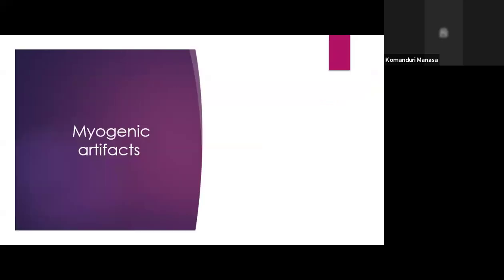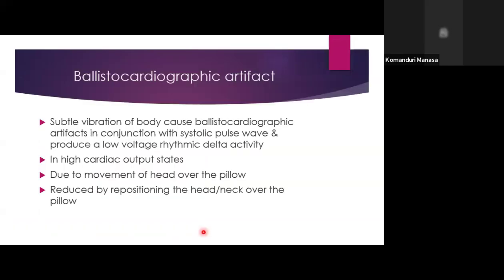We don't commonly get this, and I didn't get an image of that. In fMRI, there are studies which looked into ballistocardiographic artifacts. These artifacts are a concern in combined EEG-fMRI. It is an important artifact transmitted through the whole signal that requires motion correction. Those are more important in the EEG-fMRI studies, where we get to see these artifacts more.